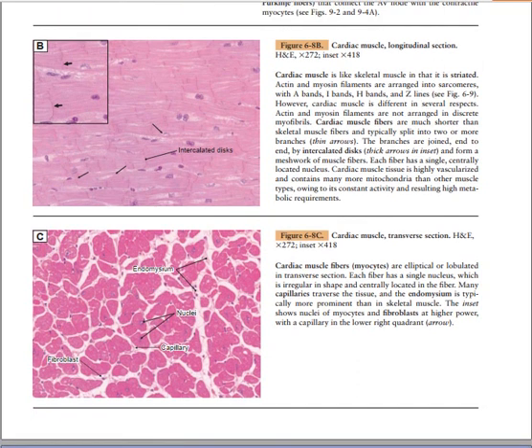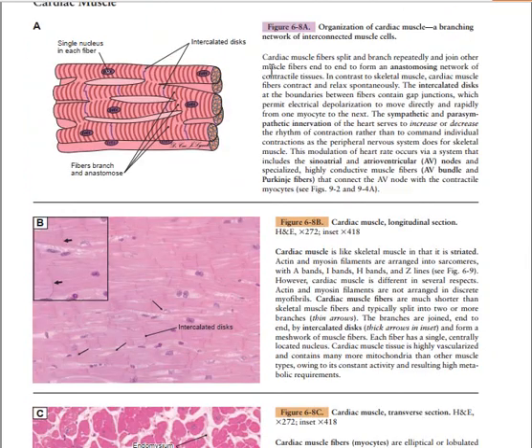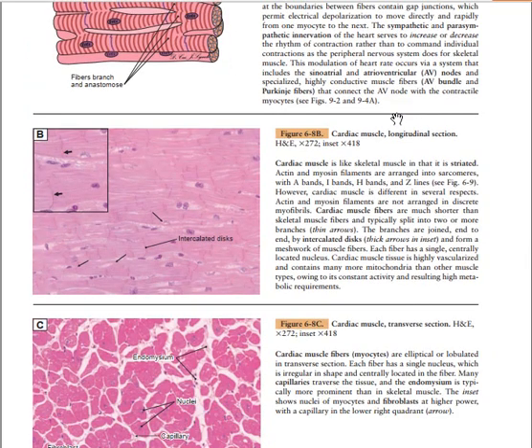Now, this was just a schematic view. This is the histology view, with the longitudinal section of cardiac muscle. When you visualize here, it is quite different from skeletal muscles, which were just elongated and cylindrical. Here you see it is much more branched. You can see one branch here, branches here like that, and then you see central nuclei. As you can see, it is much more branched.